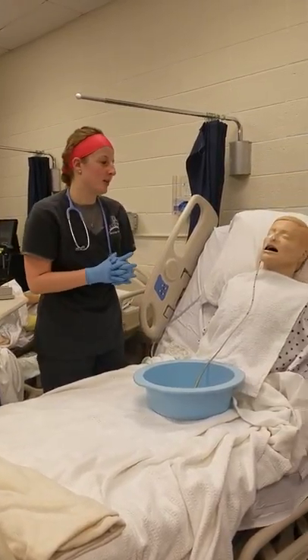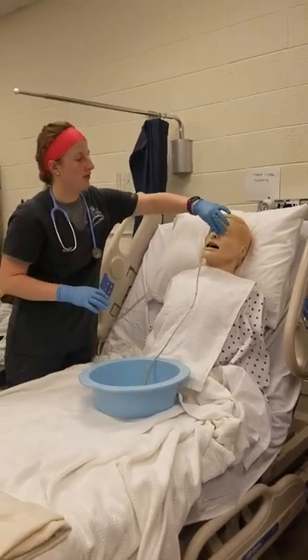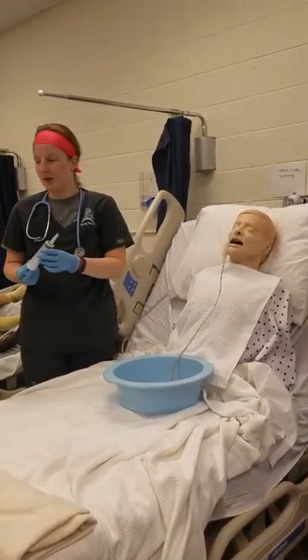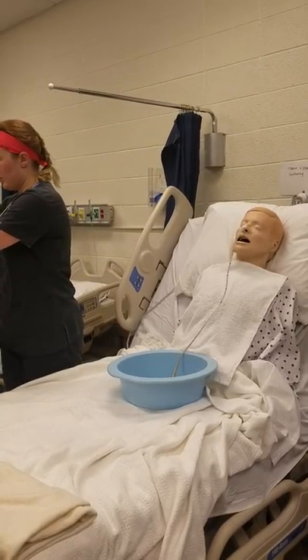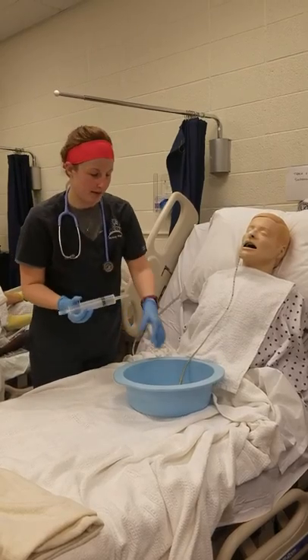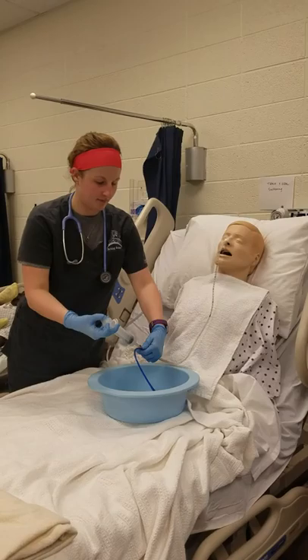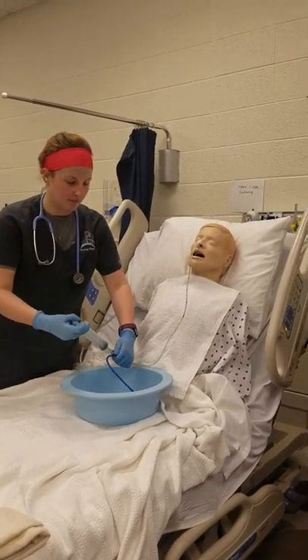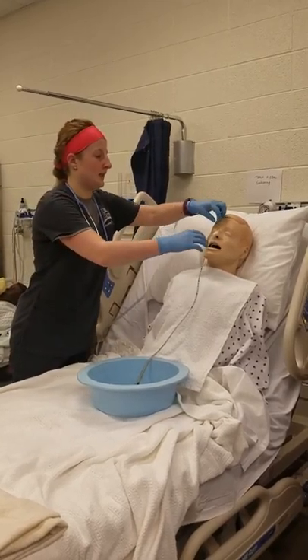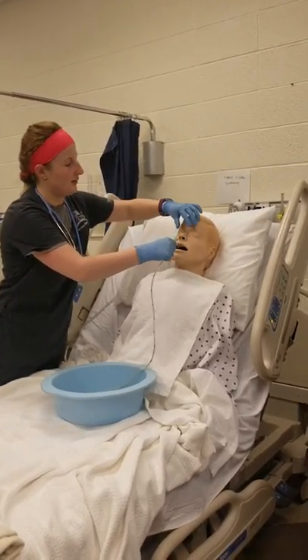Now that all of our meds are done, I'm going to go ahead and proceed to removal. Before removal, I can also check residual and then flush with 20 more mLs. I'll let them know that this is going to be slightly uncomfortable, but to take a deep breath, and then I'm just going to pull it out in one swish.